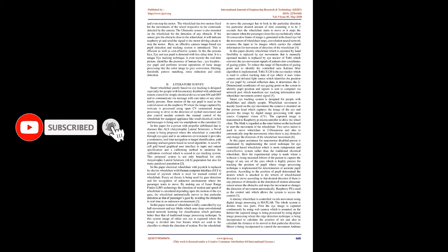In this paper, motion of the wheelchair is fully controlled by eyeball movement and eye blinks, which uses deep convolutional neural network learning for classification, which performs better than traditional image processing techniques. In this system, an image of either one eye is captured, where the image is divided into 4 frames which are sent to the classifier to obtain the direction of motion.